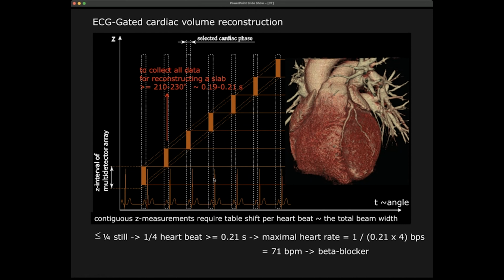Now we have one advantage, and that is a big advantage in cardiology, that mostly what you want to do is scan sick people, of course. You don't want to scan too many normal people, especially with a CT scanner that gives X-rays. You don't want to do CT scans in people that are likely to be normal.